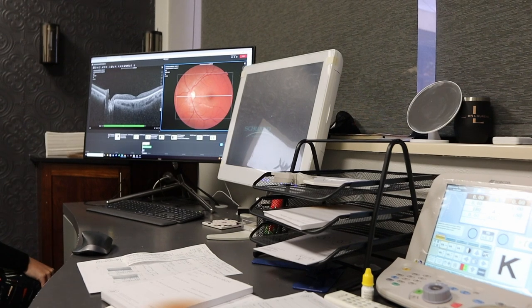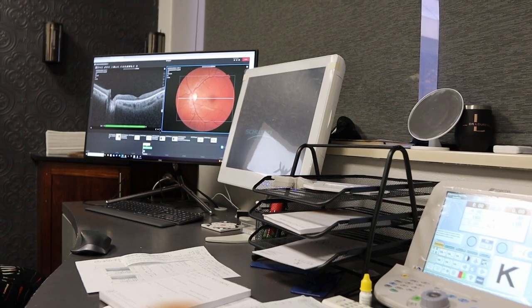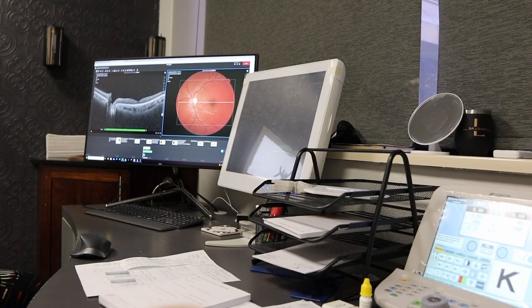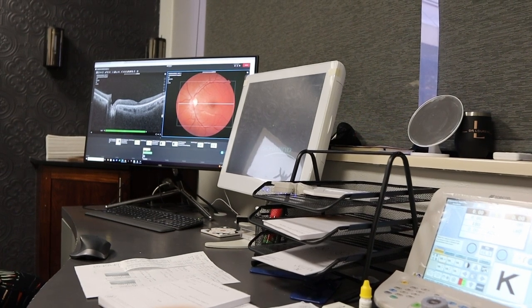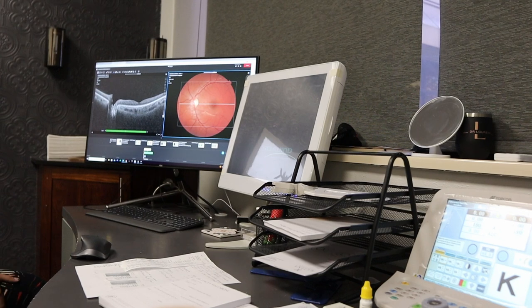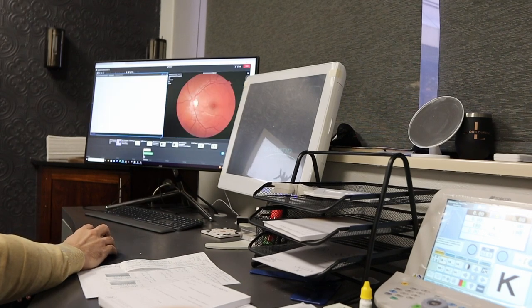the cornea. So when we look at the cornea, that's where we do the laser. And there are four things that we look at. We look at the shape, we look at the thickness, we look at the various layers, and we also look at how strong it is. So you know that little puff? Yes. That's so horrible. It wasn't bad though. That's actually where we measure how strong your cornea is. And so we're going to quickly run through that.